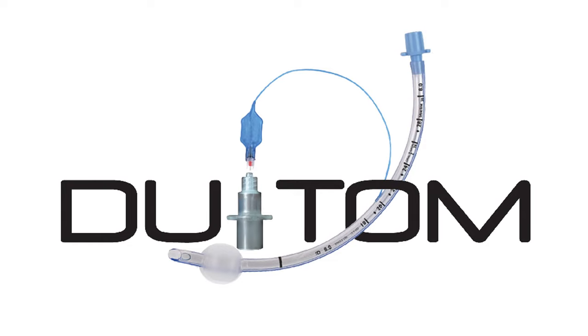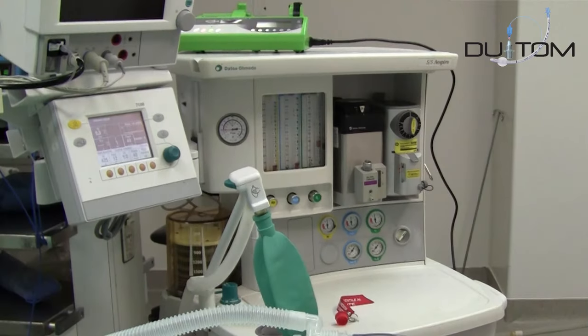Inflating and measuring the pressure of the cuff with the Duitom. To use the Duitom, you will need a fresh air supply with a way to monitor the pressure in the airway, whether by an anesthetic machine or automatic ventilator.